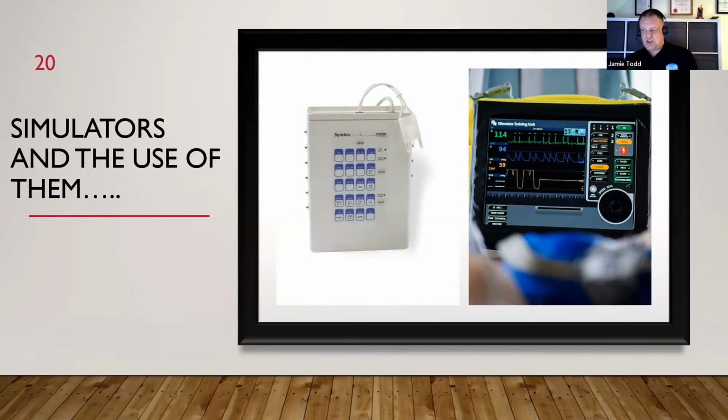Human nature tells us that whoever the tutor is will press the least amount of buttons to make something that could be a PEA. So maybe they just pick the same one every time. And if you've spent 3 years at university doing ALS scenarios and assessments, and have only ever seen one VF, one VT, and one PEA, then it's hardly a surprise that when you go into the real world and the patients haven't been to your university and learned what heart rhythm they should be in, people don't recognize the rhythm they're seeing. It doesn't look like the one they've looked at for 3 years. I think that's definitely an issue.